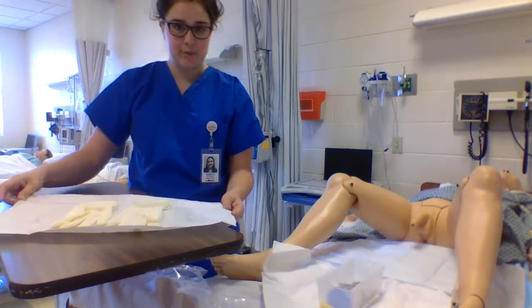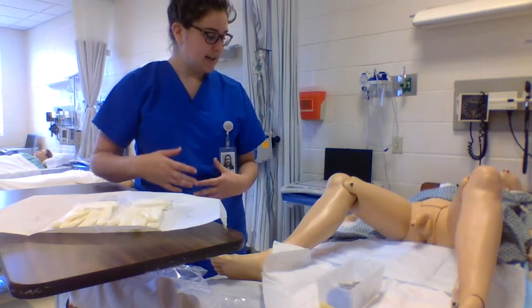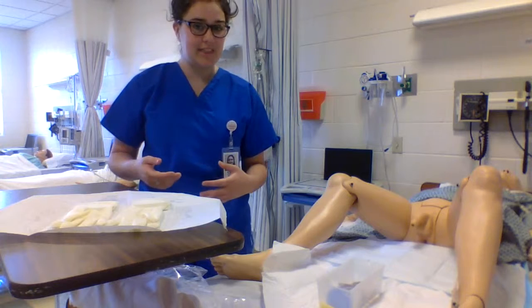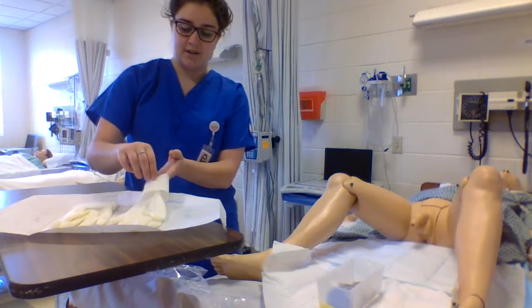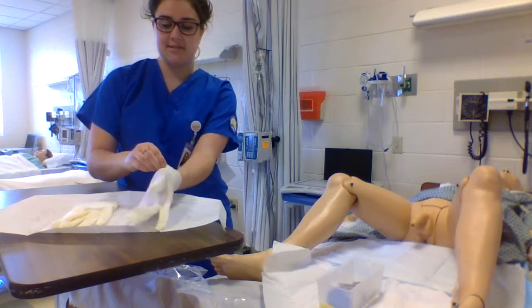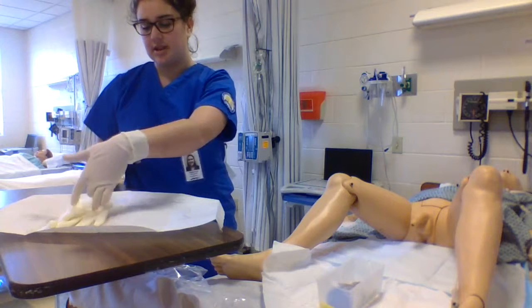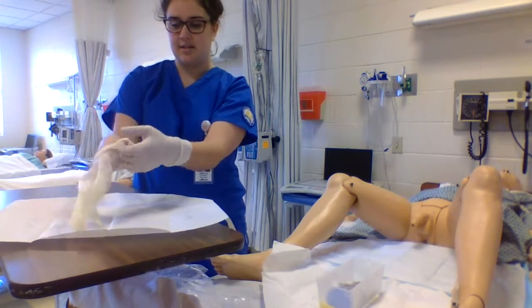I'm going to make sure that I keep the sterile field in my eyesight. That way I don't turn my back on it or anything like that. So I'm going to start off by gripping my sterile gloves and putting it in my hands. I'm going to raise it up. I'm going to make sure that I don't cross-contaminate anything.